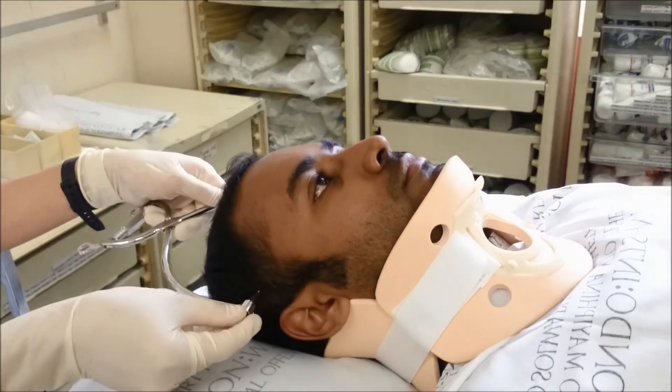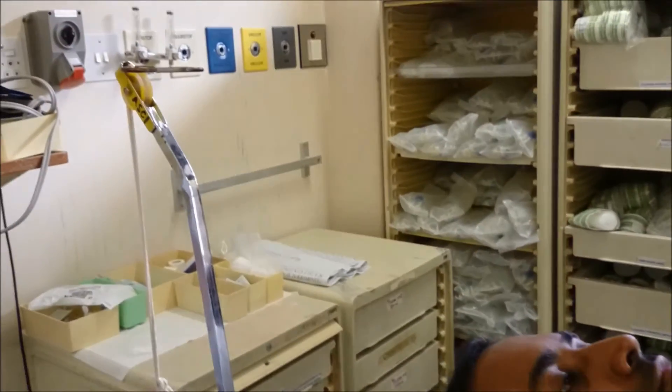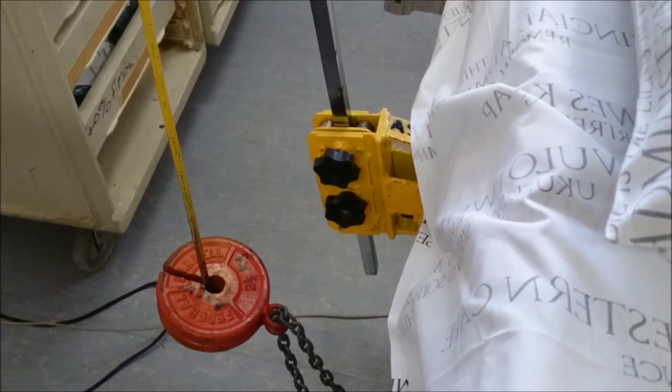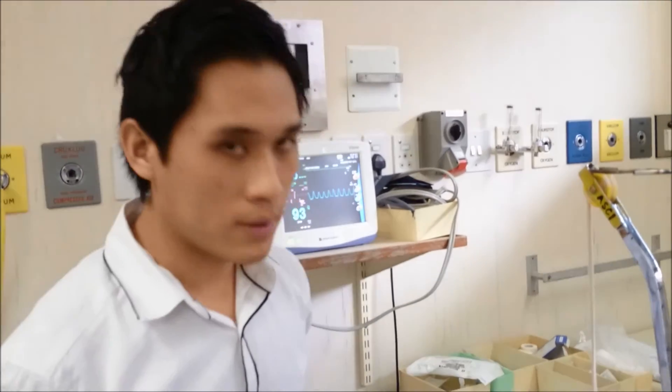Once the caliper is well secured, it is attached with the S-hook and an initial load of 5 kilograms is applied. After 10 minutes, a control x-ray is taken, and the neurological status and vitals of the patient are assessed. If the dislocation has not been reduced, an additional 5 kilograms is added and the process is repeated with a control x-ray after 10 minutes.